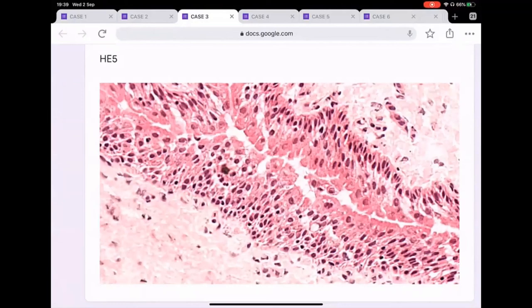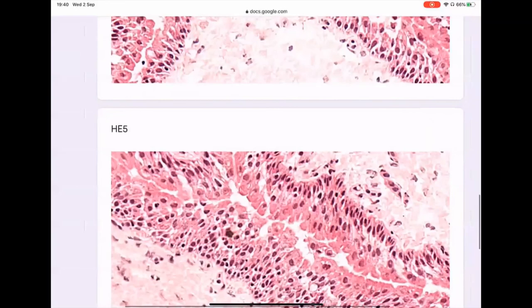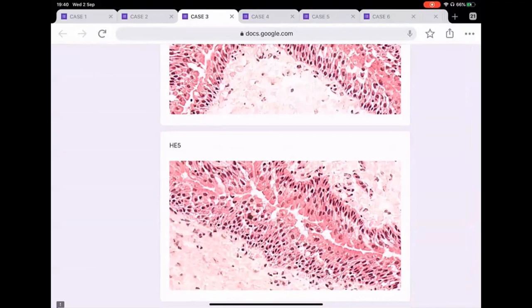And yes, if you see one mitotic figure, basal, not higher up, very basal, in an inflamed mucosa, within a population that looks very normal, then I wouldn't rely on that mitosis alone. But if I see high mitosis, I will worry then. So even if it's a single one, because it shouldn't be there, then I will be worried. So I totally agree with the initial impression that this was a benign case.